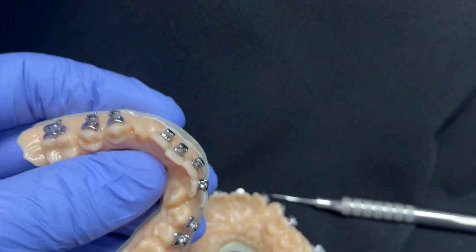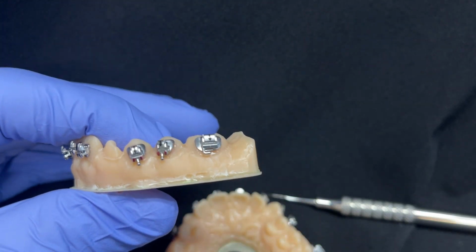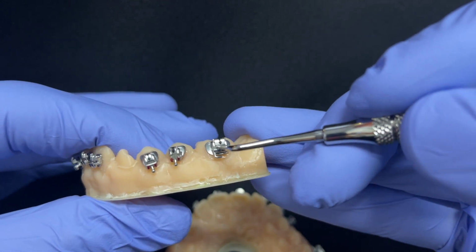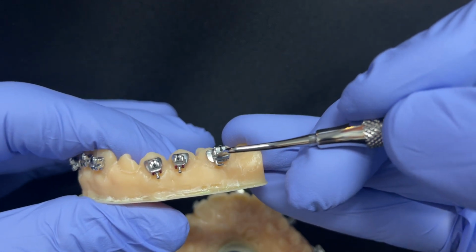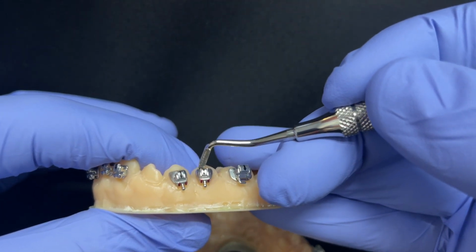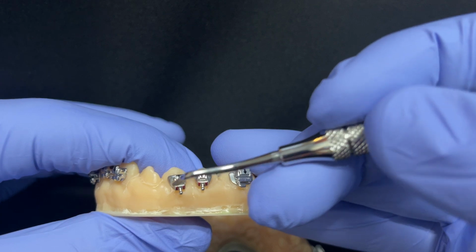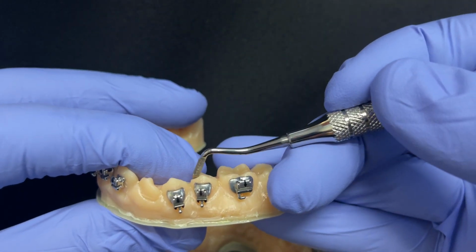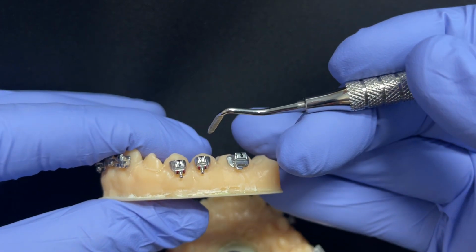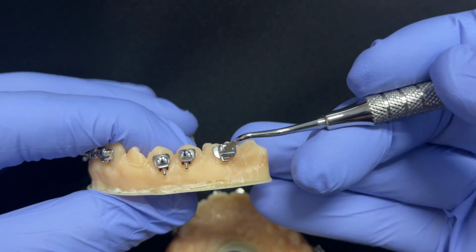So let's go around to the patient's left side, and look at those same parameters we were examining on this deep bite case, where we want to build in an accentuated curve of Spee by bringing these 6s and 7s up, bringing these 4s and 5s down, and especially the 4. The 4 is where you're really going to get that deep bite correction. We have a marginal ridge discrepancy here anyway, so we know that 4 bracket should be gingival to the 5, and the 5, once again with a marginal ridge discrepancy, needs to be gingival to the 6.